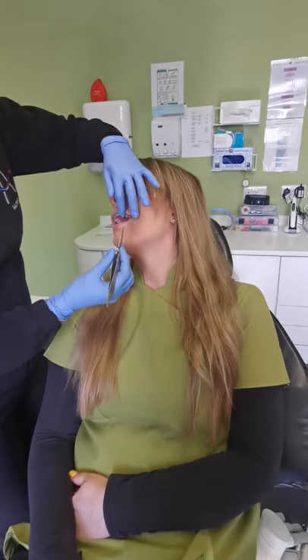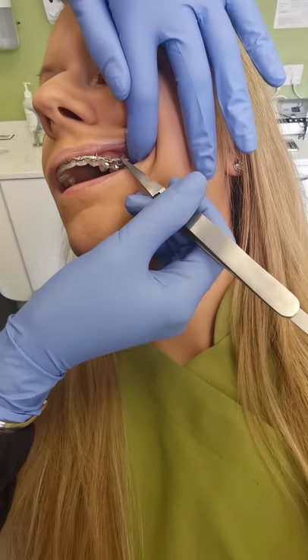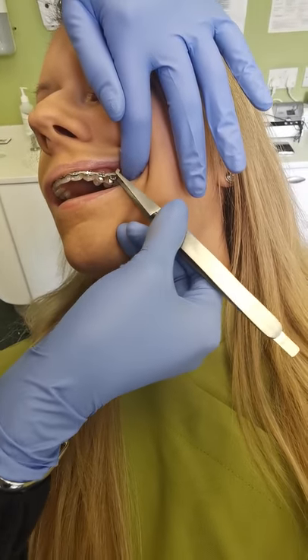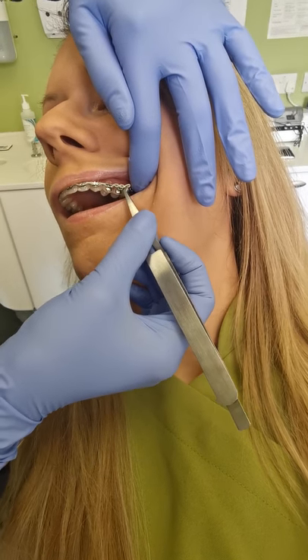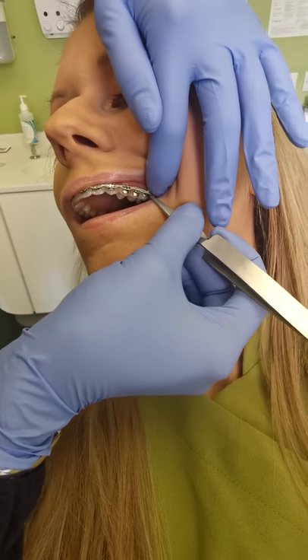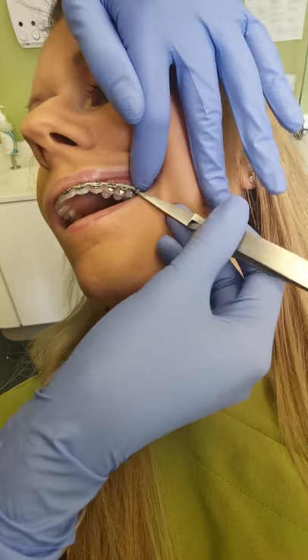So just pop your head back for me there, Rachel. If the power chain is loose like this, all you need to do is hold it with your eyebrow tweezers on the last hook and re-hook it back onto the brace.